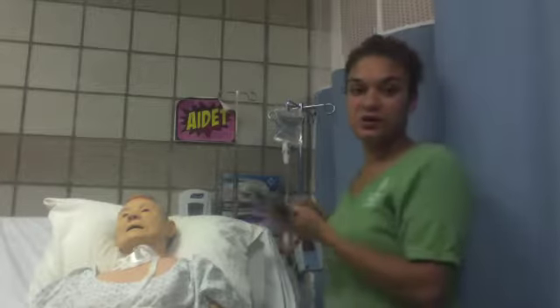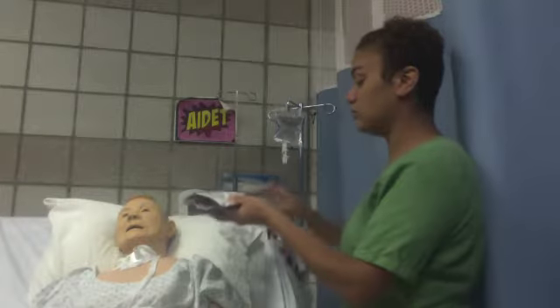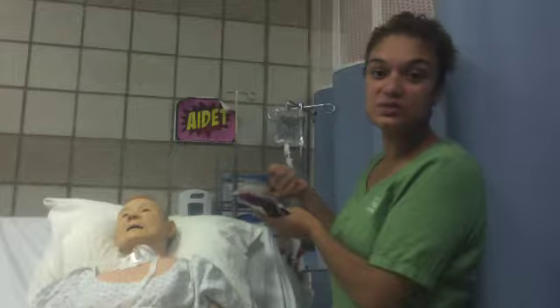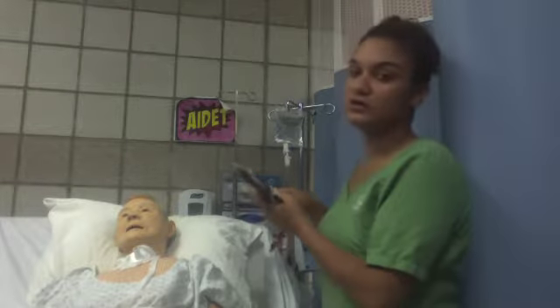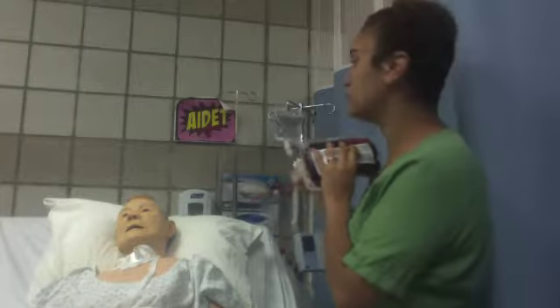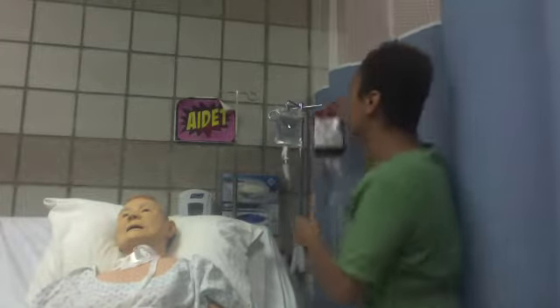Alright, to spike the bag, once I need to spike the bag, I'm going to remove the cap from the bag, I'm going to remove the cap from the tubing, and I'm going to make sure they immediately go into each other in a push and twist motion, verifying that they don't touch anything else. For this verification, for this video, I am just going to use the tape. So we've taped it together, we've done it, I've hung it.